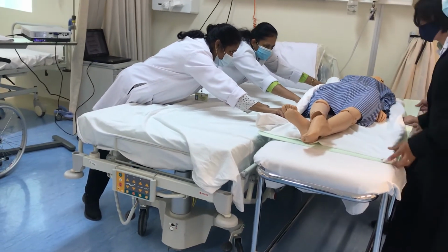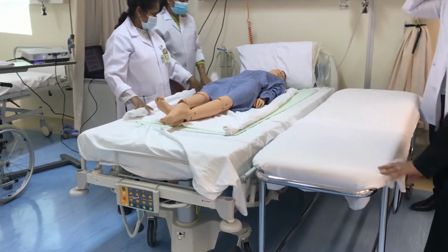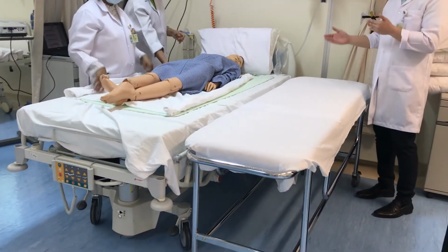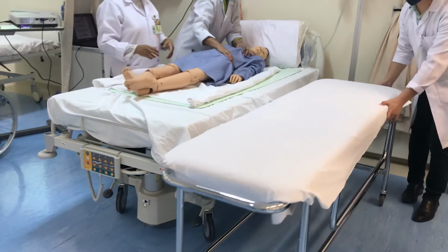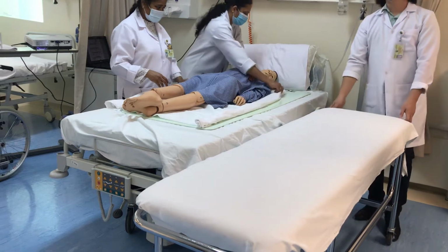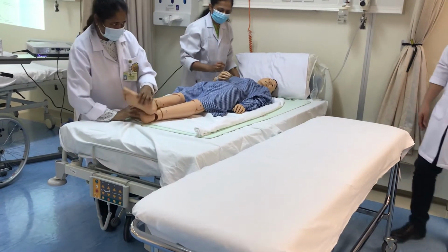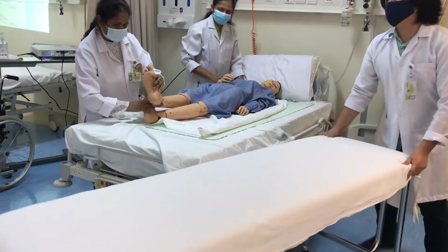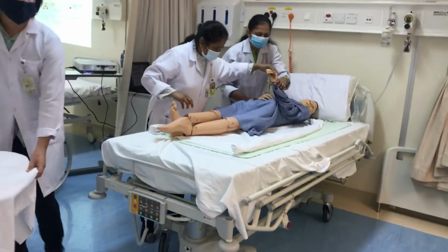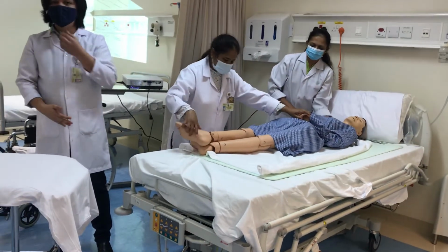The sliding is easy. So at this point, manually, we do not have the turn sheet, we do not have the butt slide, we do it manually. So at this point, we're going to position the stretcher correctly. And you need at least 3 persons to help you. 3 persons at the same side, as much as possible of the same height.